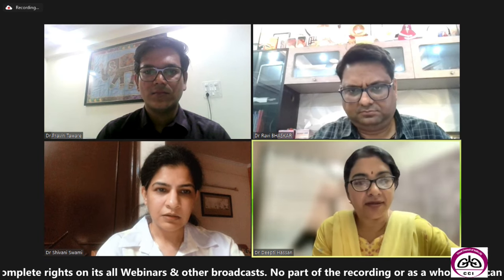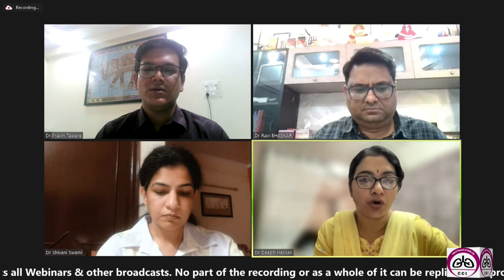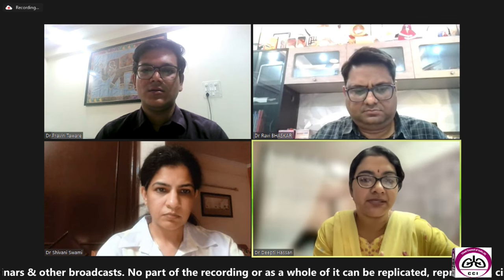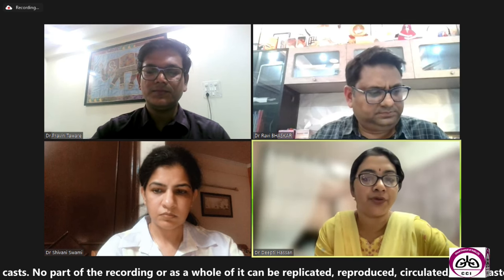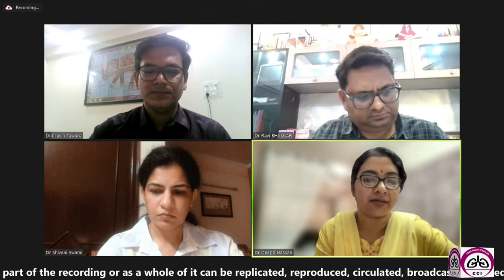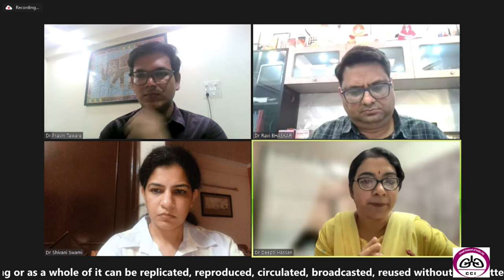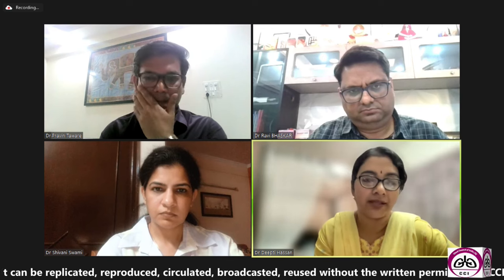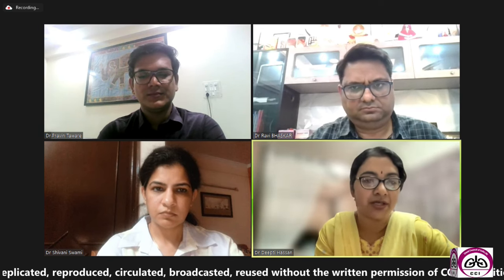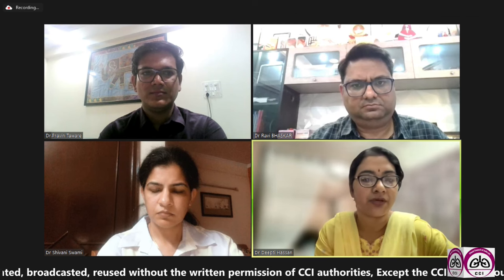So yes, ma'am, the criteria when you select an inhaler is, number one, is the patient a conscious patient? So, is the patient able to understand the technique? Will they be able to really take in the points and follow the instructions well? If it is a patient who is able to do that, then our choice is more. Whereas if that is not there, if it's an unconscious patient or a partially conscious patient, then we have only the nebulizer as our option.